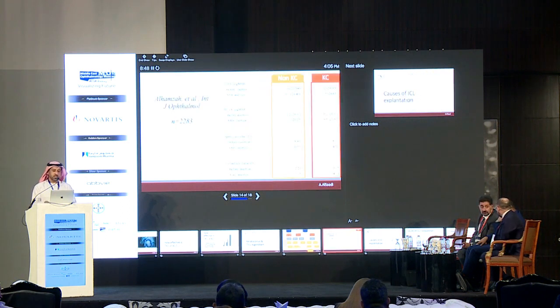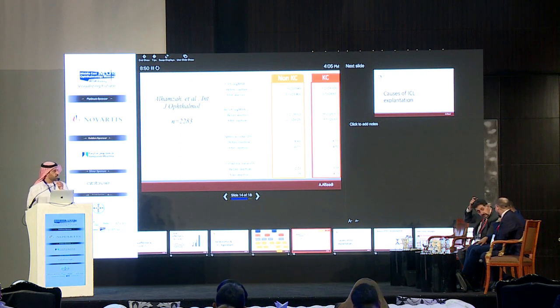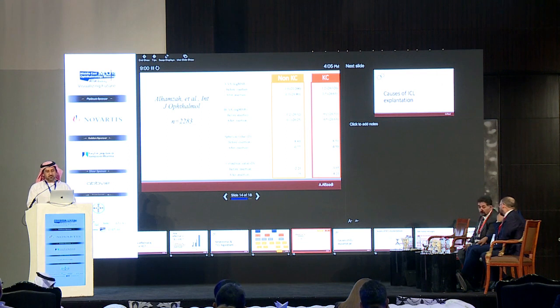There was also a big series that came from Saudi Arabia, looking at the outcome for phakic IOLs in keratoconus and non-keratoconus. Overall, they showed a big improvement, almost excellent, more than 95% of the target refraction in the non-keratoconus eyes, while in the keratoconus eyes, most of the patients improved, but still there was some residual, and the numbers are shown.